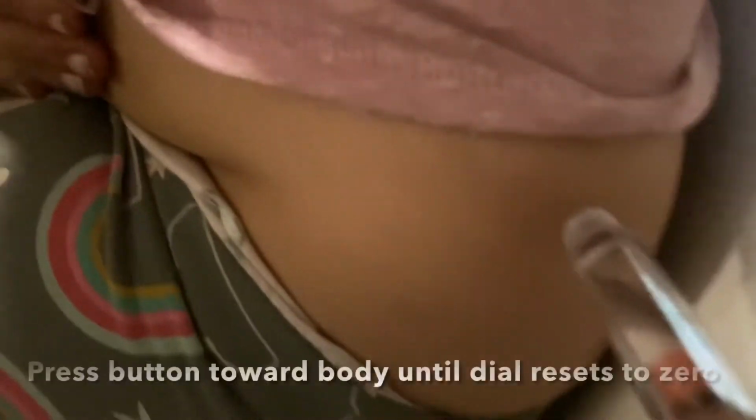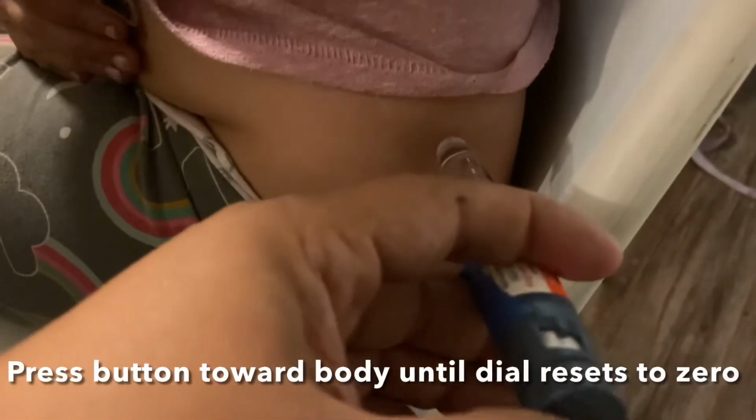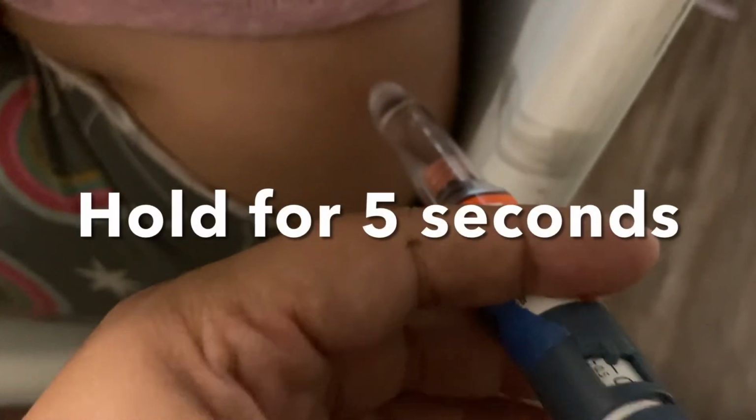So what I'm going to do is insert the needle and then press until it goes to 0. You can see it's right at 0. And then I'm going to hold it for a few seconds and then take it out. And then I've finished my injection.